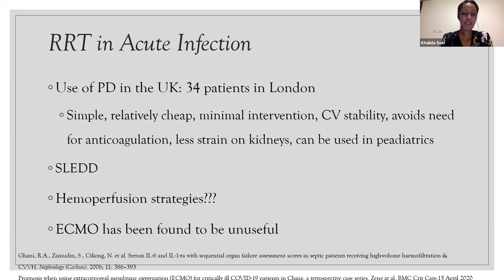So in the acute infection, what else could we have been using or thinking of using? Of course, there's the use of PD that many in the UK have advocated for, and the use of SLED. Today, we're talking about hemoperfusion strategies and the evidence that there is for them. And ECMO has been found to be not useful thus far, but in certain well-picked cases, it has been found to save lives, actually. Next slide.